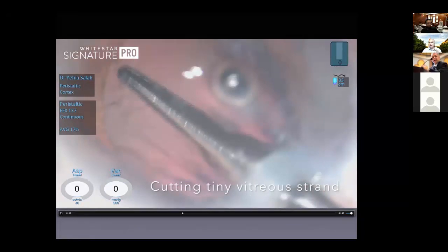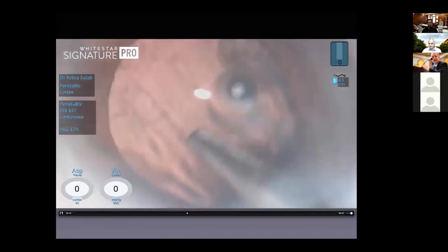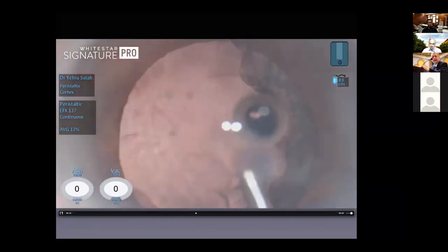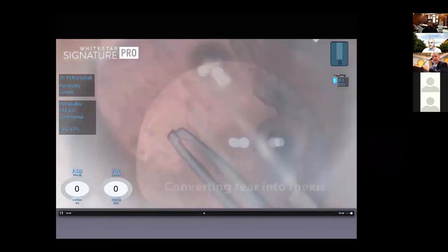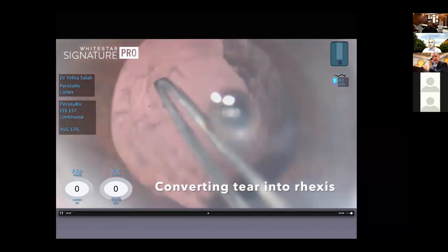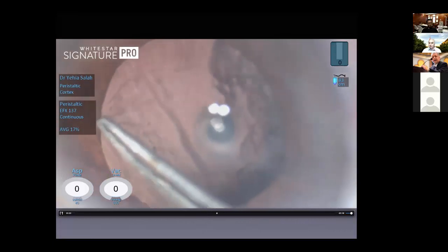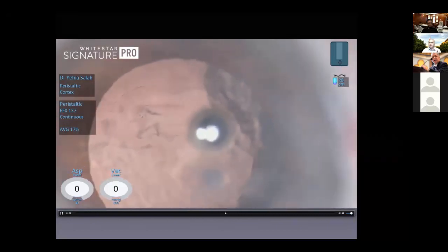Either you say, okay, I see the tear, the bag is not clean yet, I can clean the cortex with a dry aspiration and then implant in the sulcus. Or you can try to convert, there is a filament from the capsule, I cut it, inject viscoelastic. So my decision here was to convert this elliptical tear into a continuous opening in the posterior capsule without interfering with the vitreous face, by injecting viscoelastic through the opening to tamponade the anterior vitreous face and then viscoelastic in front of the posterior capsule.